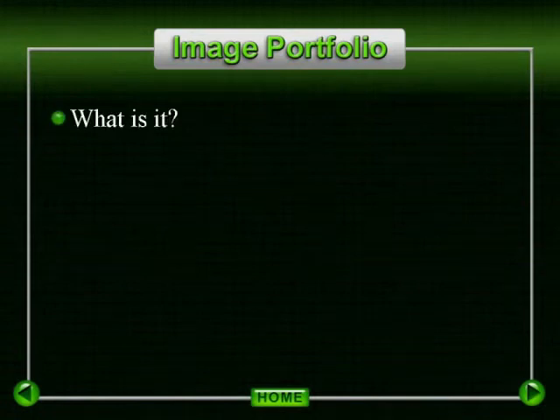Okay, so what is an imaging portfolio? There's really nothing fancy or complicated about this, but it may be a concept that you do not consider initially until you receive complaints. Basically, an imaging portfolio is a file of significant images that are saved for subsequent review. It should provide a brief overview of each case.